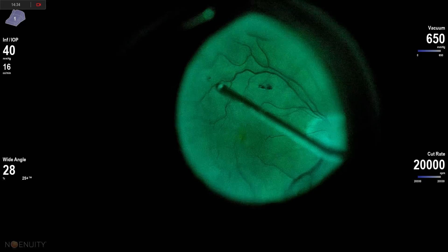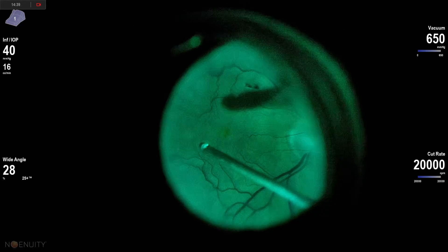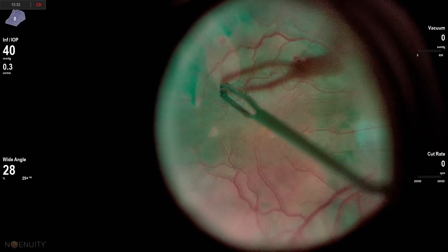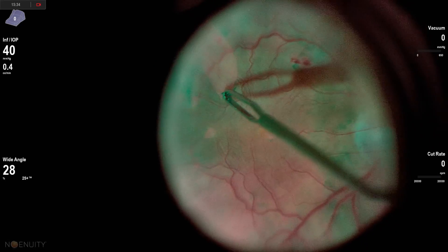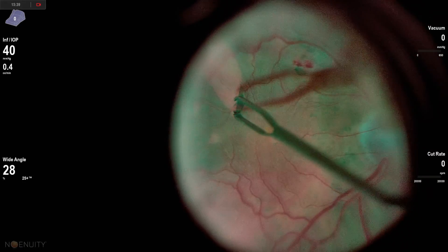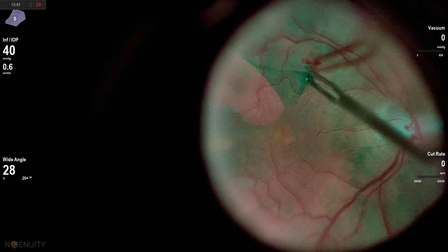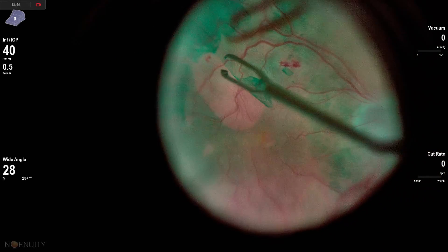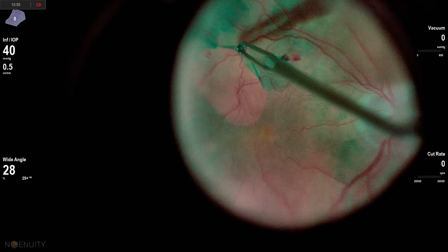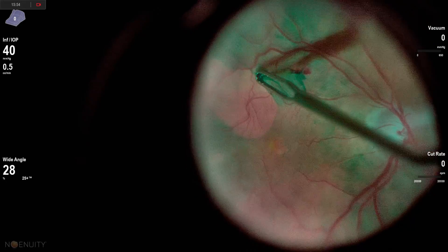I'm going to re-stain with ICG here and remove it from the fluid-filled eye. As we're removing the ICG, we can now see there's already a little opening where some internal limiting membrane came up on the backside of the epiretinal membrane. So we're going to go in and grab at that edge to get the internal limiting membrane up throughout the macula. It decreases the scaffolding that epiretinal membrane cells can re-proliferate on, and can be a real game changer for our patients.